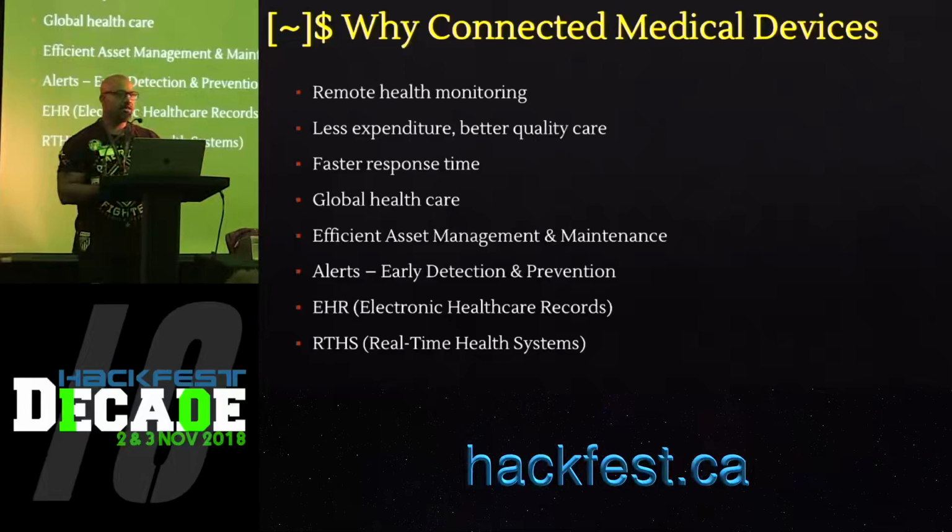Initially, we started doing it manually, but we figured it might be a good idea at this point to start fuzzing this thing with different kinds of packets. So we wrote a Python library, which would receive messages from the infusion pump, create different kinds of responses, and send them back to the infusion pump. After doing this for a while, we started deciphering some of the message types.